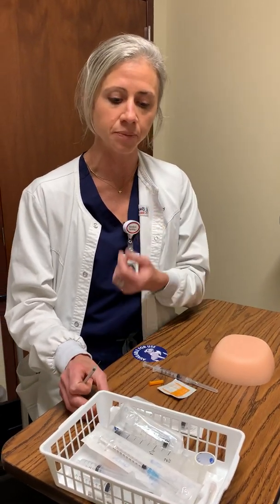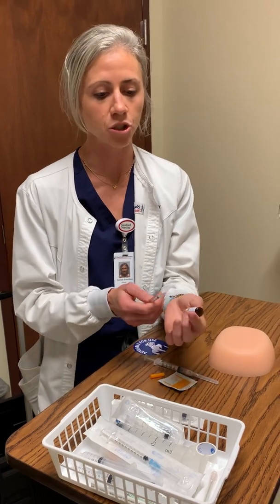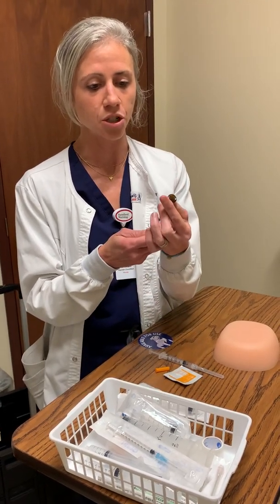So when you draw up your insulin, you're always going to, once again, go through all of your medication rights, but you're going to always want to get another nurse to verify that you have the correct dosage, okay? Units of insulin, or if you give a patient too much insulin, can we kill a patient? We can, okay? It's a scary drug to give. And once again, we already went through where that's given. That's given subcutaneously. So I'm going to draw up my insulin, okay? I'm going to have my insulin drawn up, kind of just pretending to do this, okay?